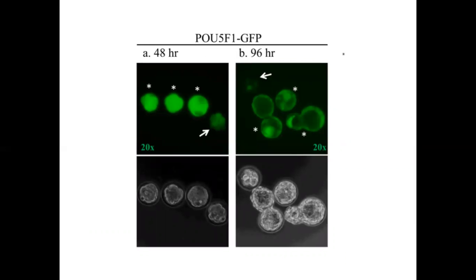So here are more pictures that show how MEGA works. You can see still two time points. The first series is at 48 hours. At 48 hours, it's still at the cleavage or morula stage for mouse embryos. For those good embryos, there will be really strong green fluorescence under the scope. And for the ones which have less potential to develop further or to be implanted, there will be weak green fluorescence.